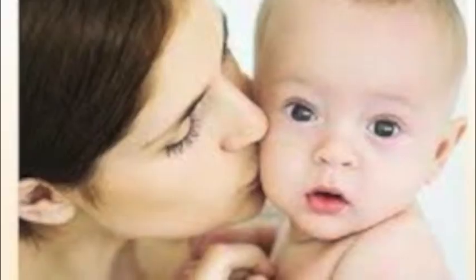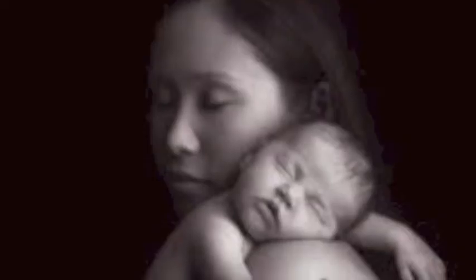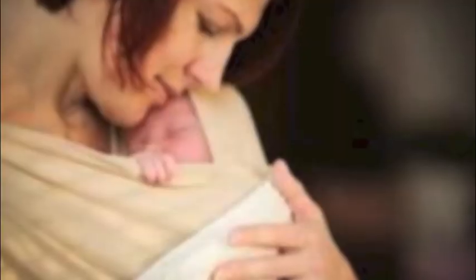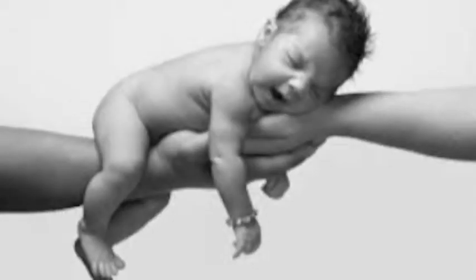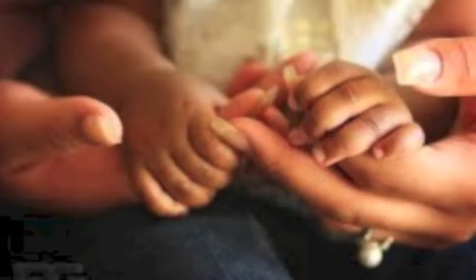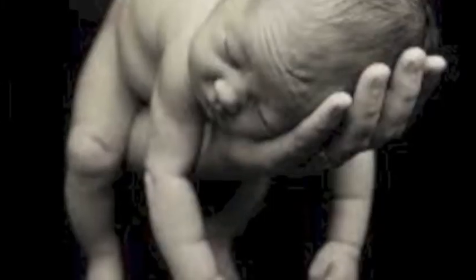Looking ahead, isolettes will continue to develop. They will change as the needs arise and as technology advances. We predict that they will become lighter and more portable, have smaller footprints, more options, humidifiers, equipment, and accessories. Isolettes will become even more beneficial than they are today, but we fear they will never be able to satisfy one major problem: the lack of bonding between mom and baby while the baby is in the isolette.